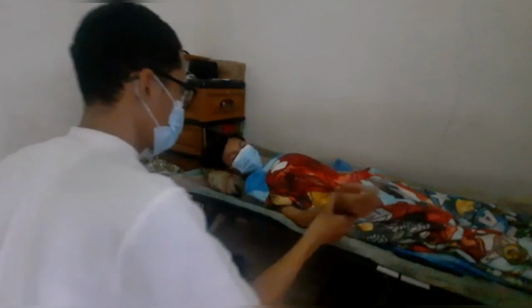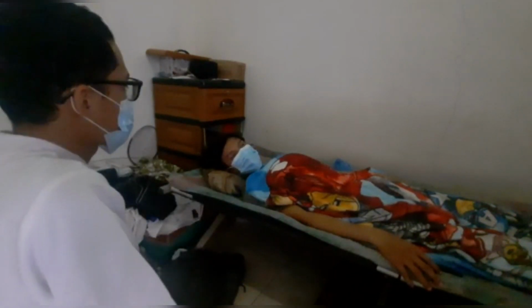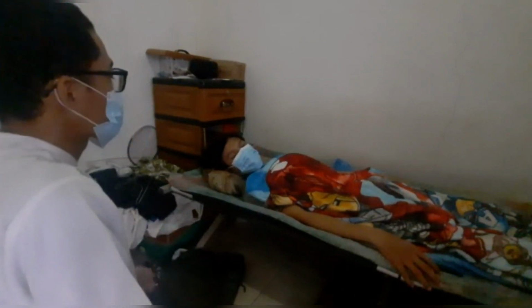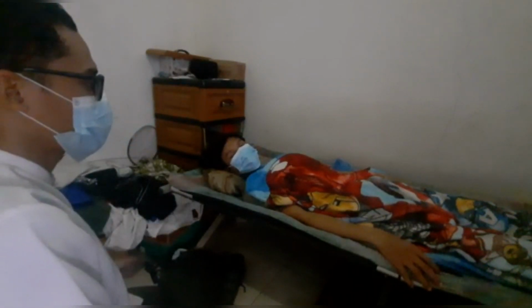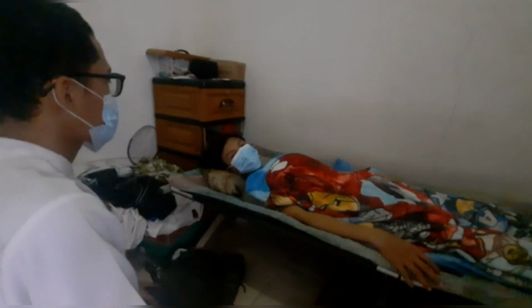Okay, it's done. Fine. Your pulse is normal. It is 80 beats per minute, and your respiration also good. It is 18. Okay. Yes, alhamdulillah. Okay, I have done. You can rest again, Mr. Katon.